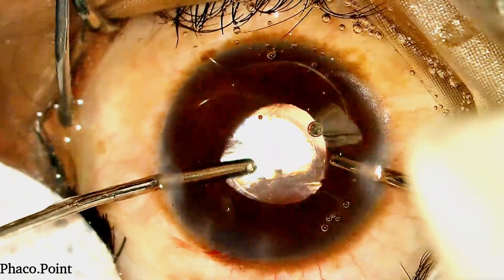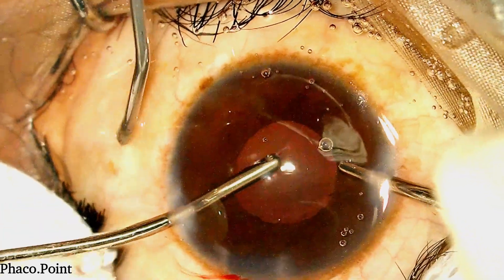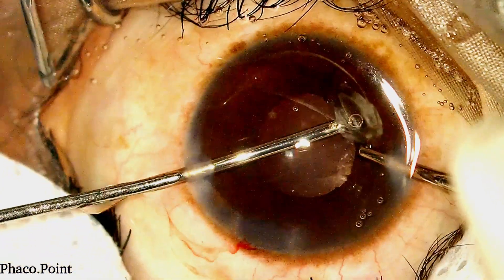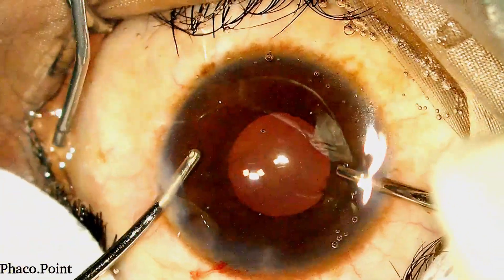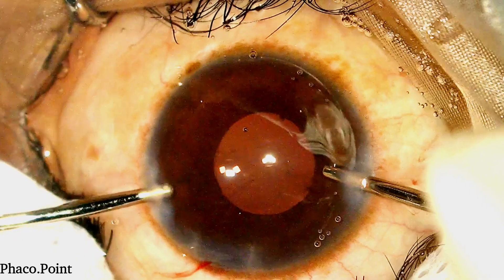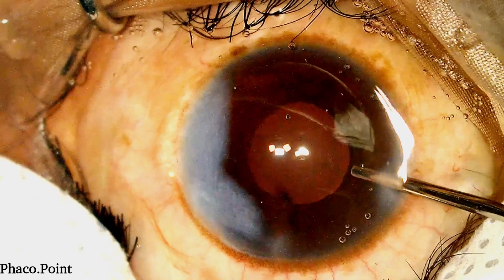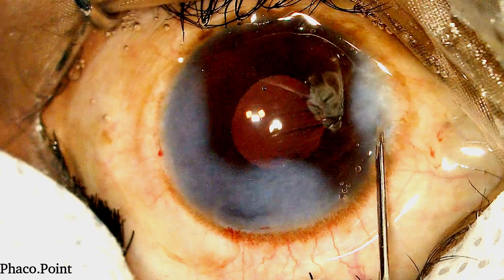We now come to the penultimate step: washing out of the viscoelastic. A gentle movement of the IOL would result in removal of all the viscoelastic, including that trapped from behind the IOL. In cases like this, I would refrain from going behind the IOL either with the irrigation or aspiration to wash out the visco. After removal of the viscoelastic, we come to the last step: stromal hydration. The stromal hydration should also be performed reasonably gently, as excessive pressure whilst performing stromal hydration itself can result in a disruption of the posterior capsule.